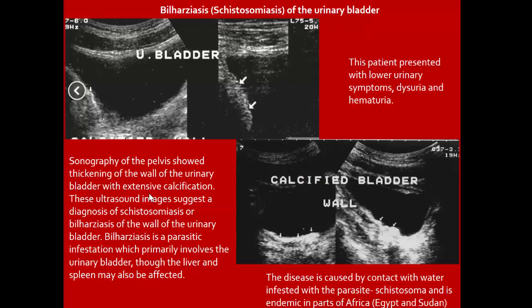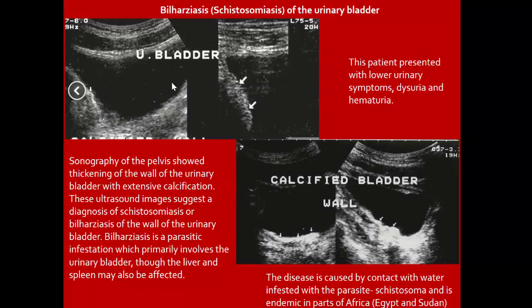Another case of schistosomiasis of the urinary bladder shows thickening of the bladder wall with extensive calcification. Patient presents with urinary tract symptoms and hematuria. Sonogram also suggests the diagnosis of schistosomiasis, caused by contact with water infested with the parasite, showing bladder wall thickening, calcification, and irregularity.